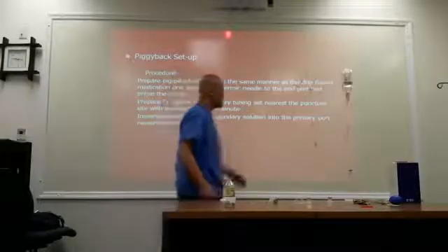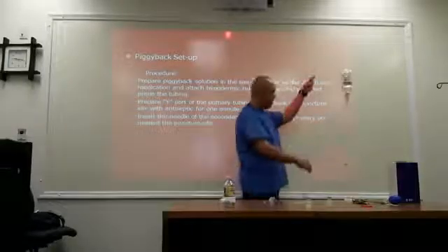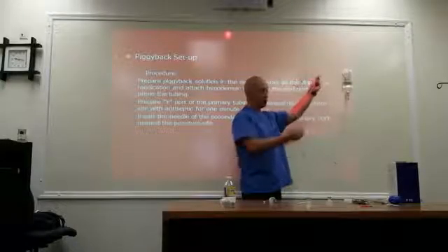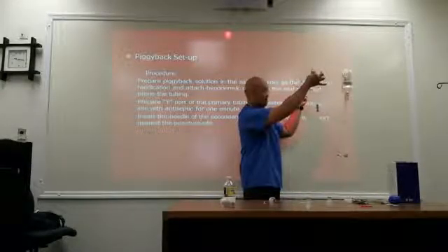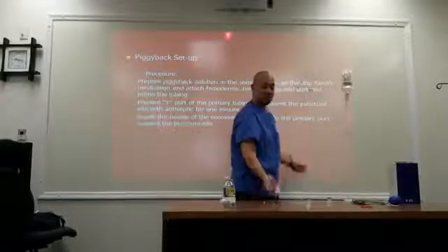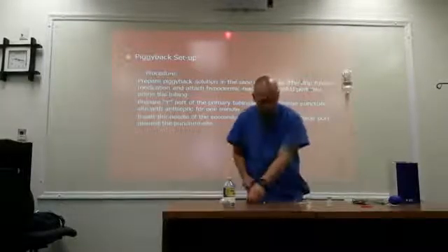When you guys are looking at these lines, they have what's known as side ports. Here's a side port. Here's a side port. What I'm going to do is the same thing. I think I used up all my fluids.